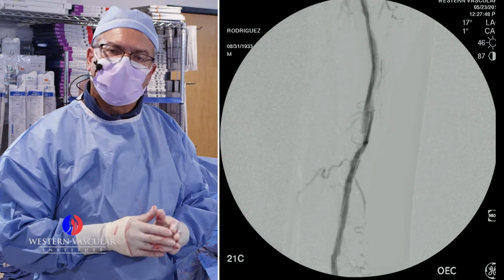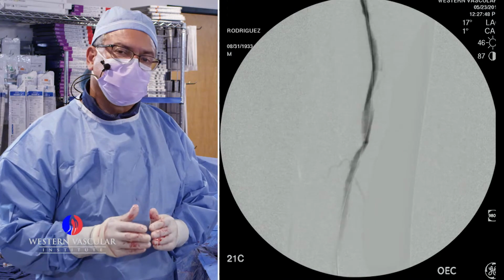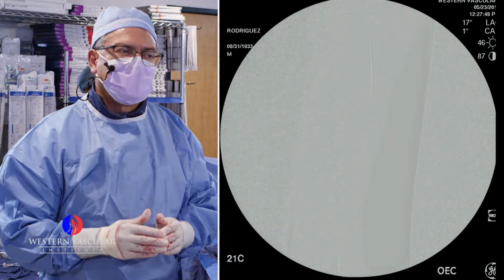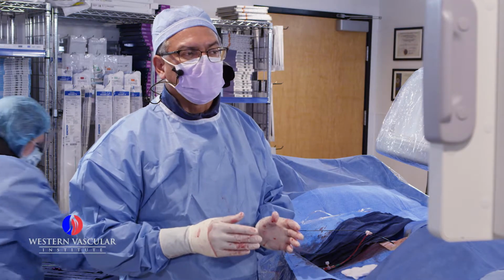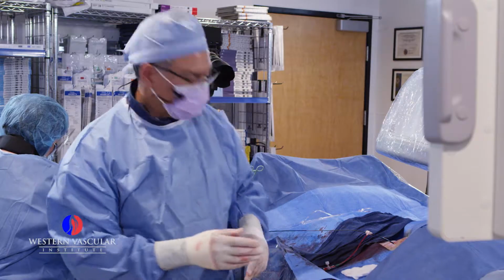If you are too close to the surface of the artery, you may end up cutting too close, and then you finish with a perforation. So the decision of what device you want to use is important. I think here we have to stay simple with the stent to get an adequate result.